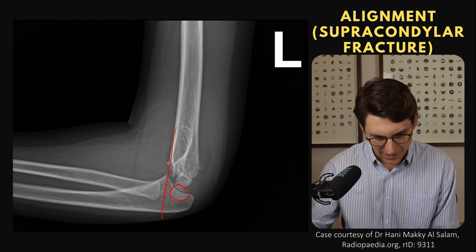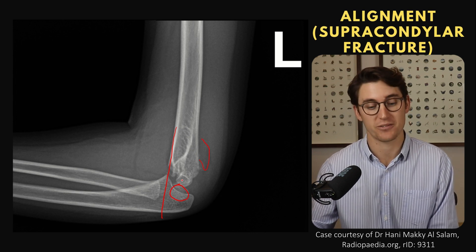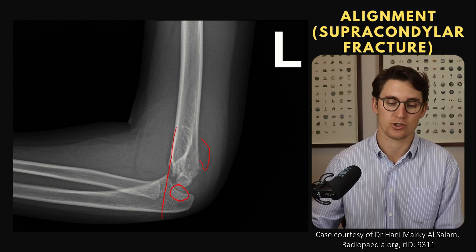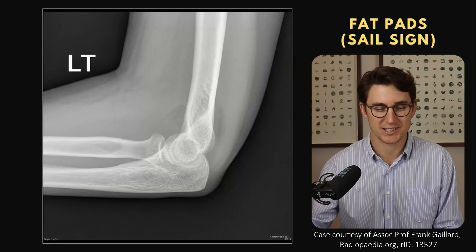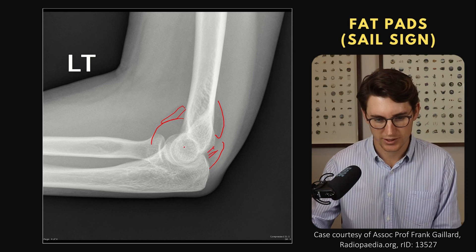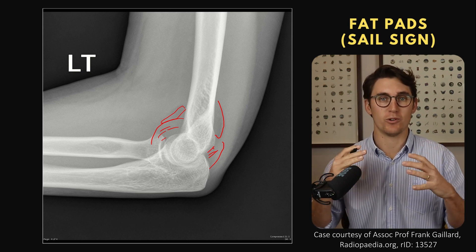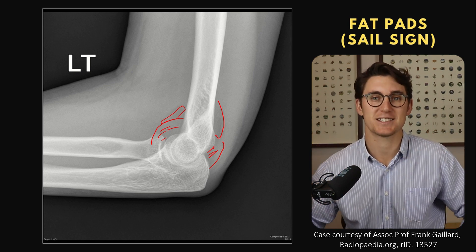Drawing the anterior humeral line here, we can see it misses the capitellum — here we've got a supracondylar fracture where the capitellum has been displaced posteriorly. Sometimes this malalignment is the only sign you'll see, and you should then investigate further for a supracondylar fracture. We can also see the anterior fat pad and the posterior fat pad here. The posterior fat pad is deep in the olecranon fossa — we should never normally see it. When it's visible it indicates a joint effusion pushing those fat pads out of the fossa.